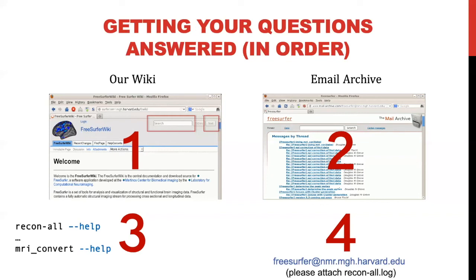To run them in batches, I think that goes back to the Launchpad cluster that I talked about. I'm trying to find the slide, but basically this is a really helpful way of you just submit multiple subjects. I know we have scripts available, but also I cannot find the slide for the life of me.